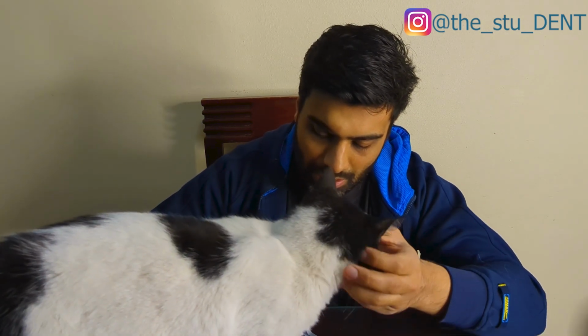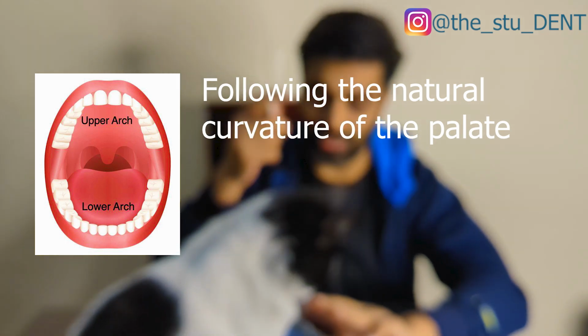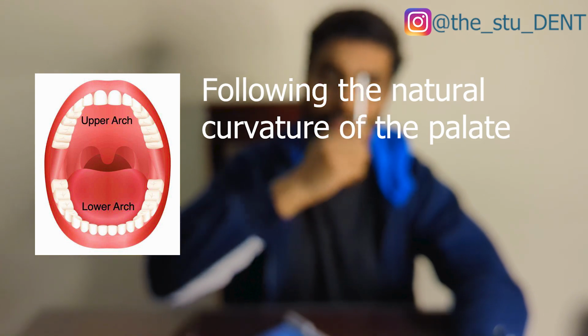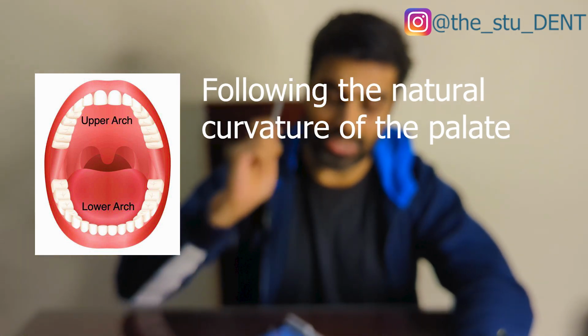So with the palatal side of things, we also need to have a y-axis and an x-axis. So the y-axis will again be through the center of the tooth, following that line. So the center of the tooth through the root, which means we're getting an arching form through the palate itself. And then the actual x-axis will be the midway point between the hard palate and the cervical region of the tooth we're looking to anesthetize.